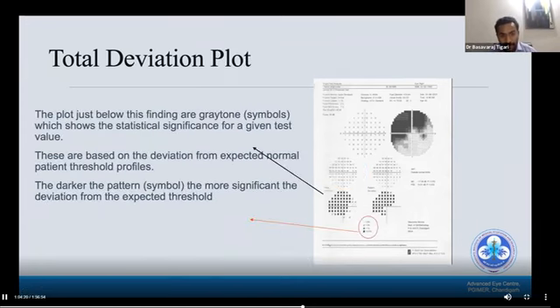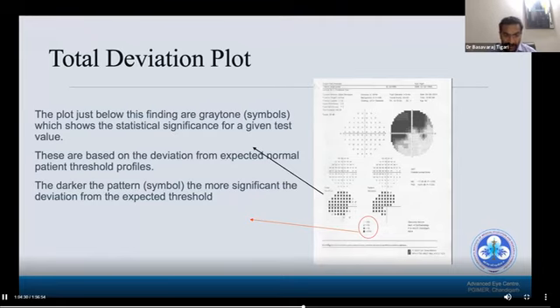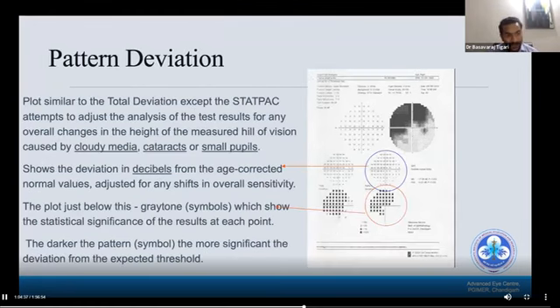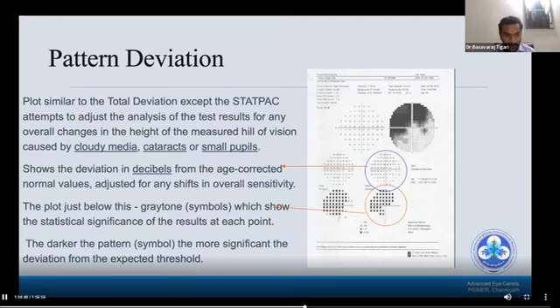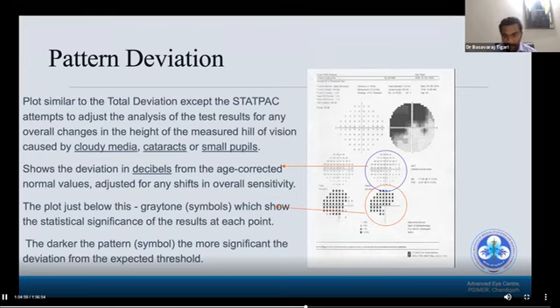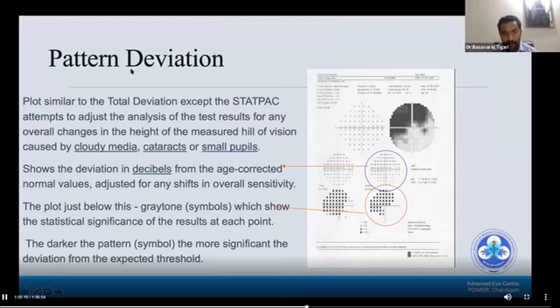The total deviation plot below the numerical findings uses grayscale symbols showing statistical significance, where the darker the pattern, the more significant the deviation from the expected threshold. Pattern deviation is similar to total deviation, except STATPAC adjusts the analysis for any overall changes in the height of the measured hill of vision caused by cloudy media, cataracts, or small pupils. So when a patient has a cataract and cannot see properly but the disc and retina are normal, pattern deviation is the most important plot to review.